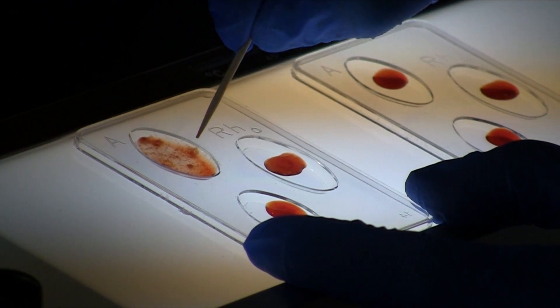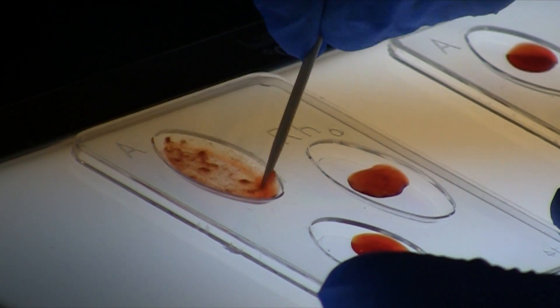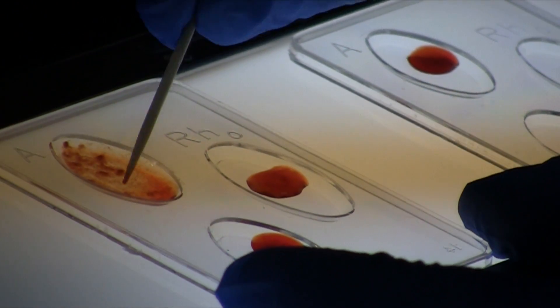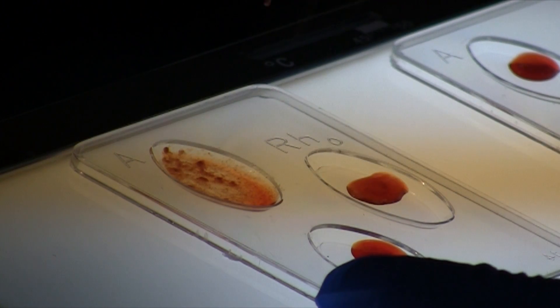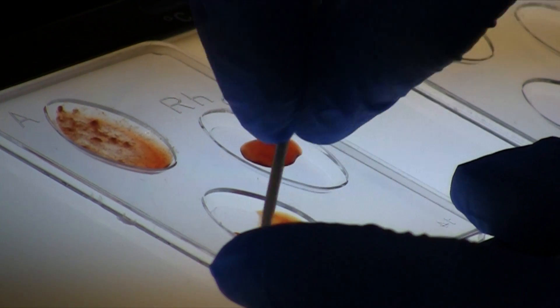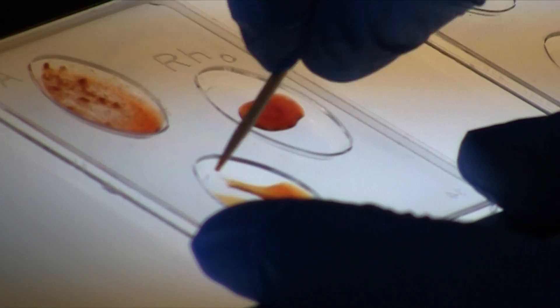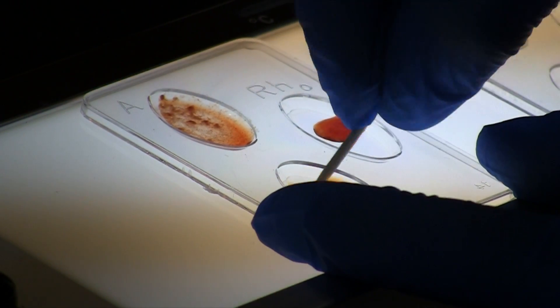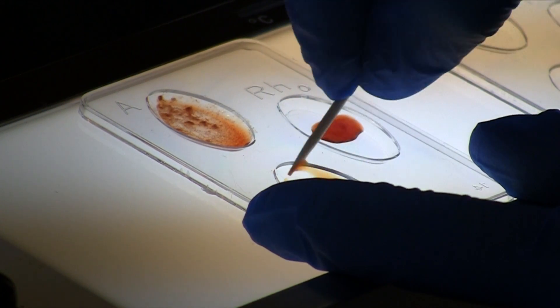The best way to mix is to really spread the sample all over the bottom of the well. Can you see how nicely well A is agglutinating? There's a lot of clumpiness in that well, so this person clearly has the type A antigen on their blood cells and it's interacting with the type A antibody — this person has type A blood. Now the question is, do they have just type A or type AB? Let's mix the B well and see if there's any clumpiness. It looks like type B is a little harder to mix, and I don't see any clumps. Spread that around — there's really no interaction, no agglutination. So this person lacks the type B glycoprotein and does not have type B blood.